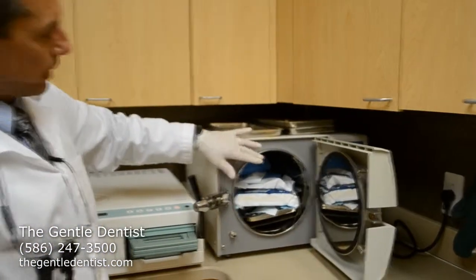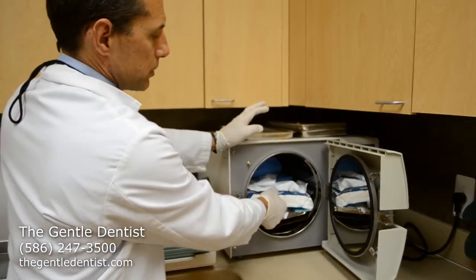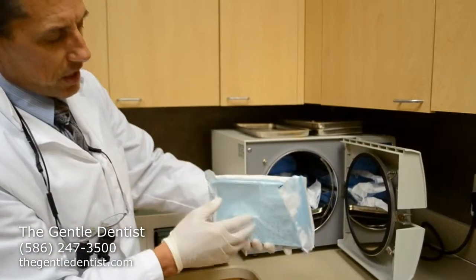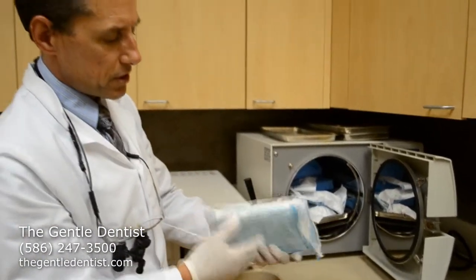The other option is to sterilize the instruments here. We load up our autoclave, which has a number of different shelves on it. Many of the instruments we use, especially the surgical ones, we wrap up first before anything else is done. So these are wrapped up and ready to be sterilized.